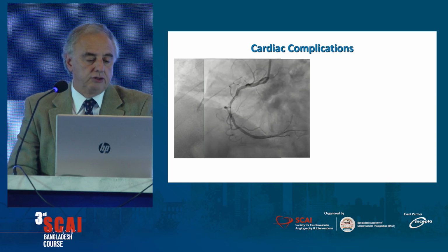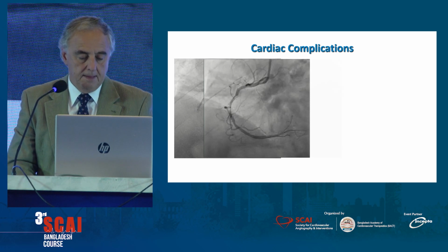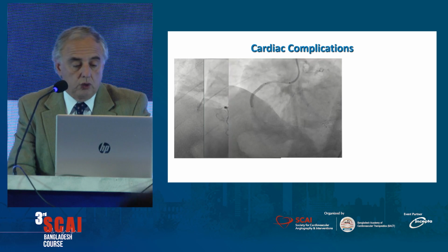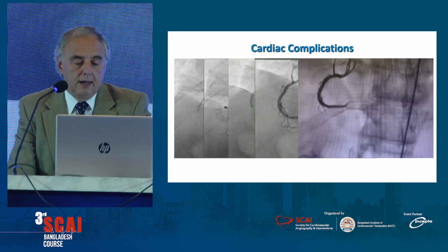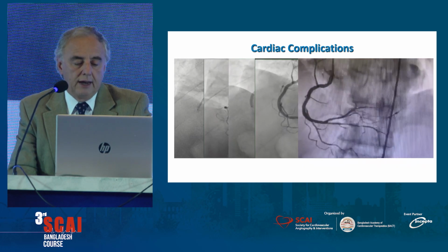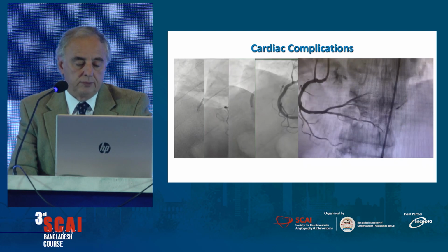So another perforation that you can have is a perforation in the distal vessel. This is a simple intervention, it was not a CTO, but it doesn't matter, that makes the point. It's a simple intervention here, and we have the wire here. But if you look here, you do the balloon, and you don't see the wire any longer. So the interventionist thought that everything was wonderful. He takes the last picture, and you see that there is a distal perforation through a wire that was all the way here, and in this tiny branch, it goes a very significant perforation.